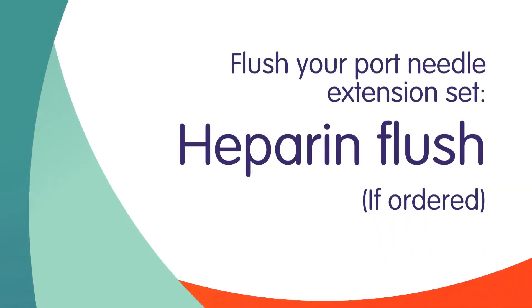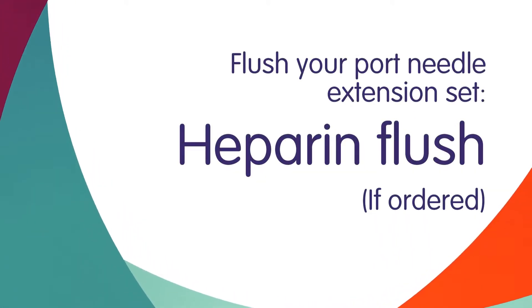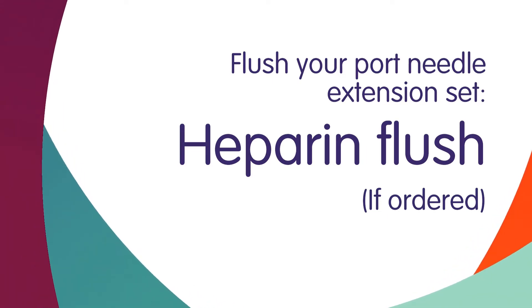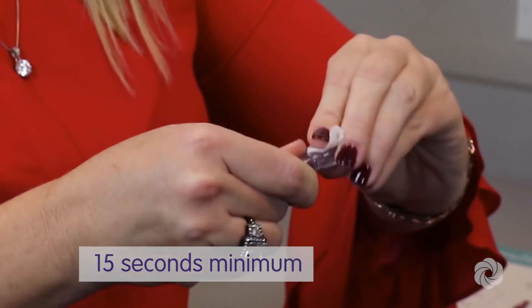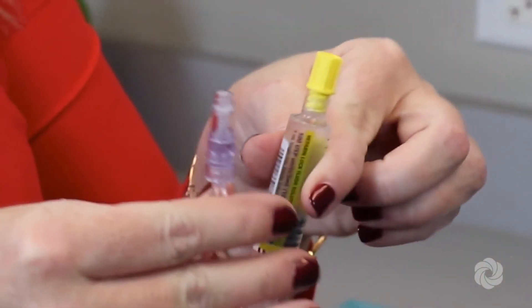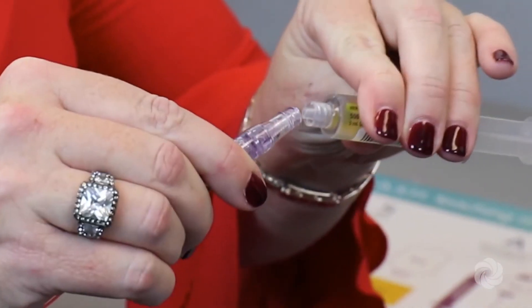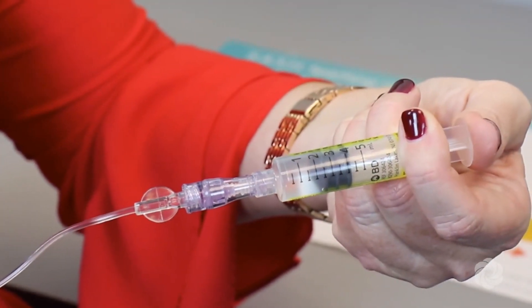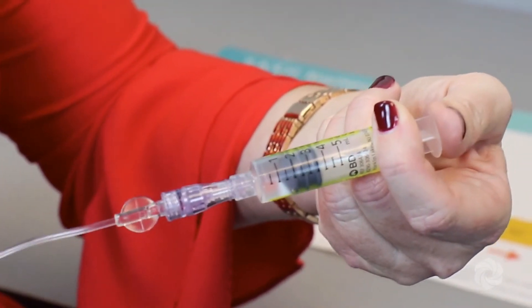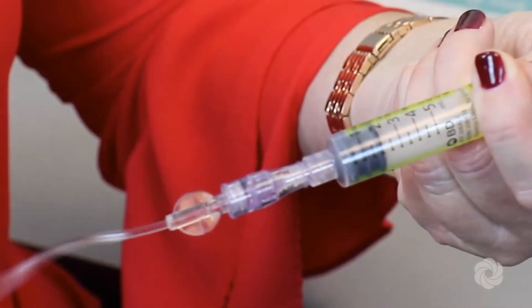Following this step, you will flush the port needle extension set with heparin, unless your port has a Groshong tip, such as a power port. Scrub the injection cap for at least 15 seconds and allow to air dry. Remove the protective cap from the heparin flush syringe and attach it to the injection cap. Flush tubing using a push-pause method. Close the clamp on your tubing. Lastly, remove and discard the heparin flush syringe in a trash container.